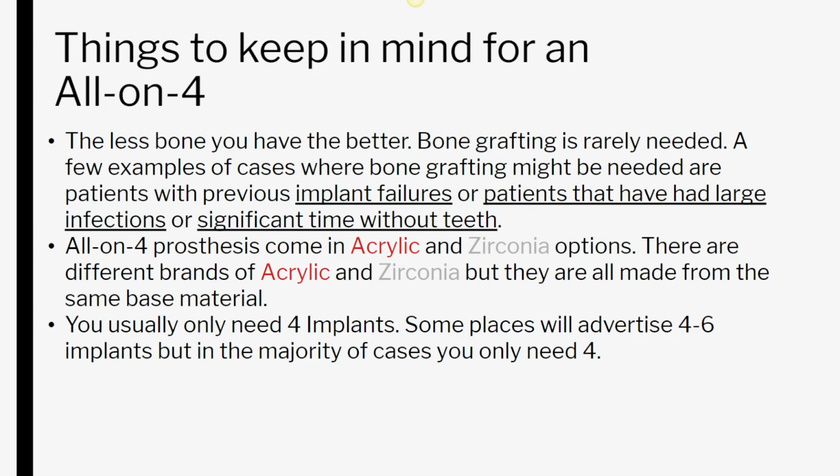So that's definitely something that you want to avoid. Without going into too much detail, the all-on-4 prosthesis needs enough space, so it's actually a better option if you don't have a ton of bone available. If you don't have that much bone, it's not a big deal, and the all-on-4 solution is a great way to take care of patients who have compromised bone.